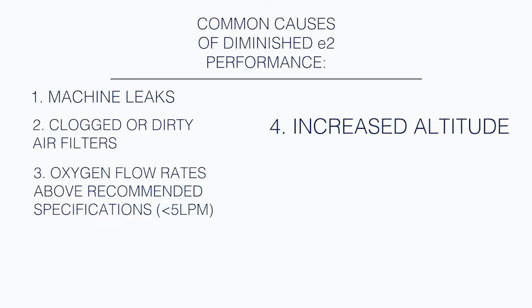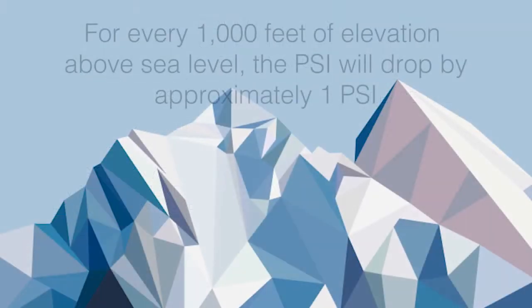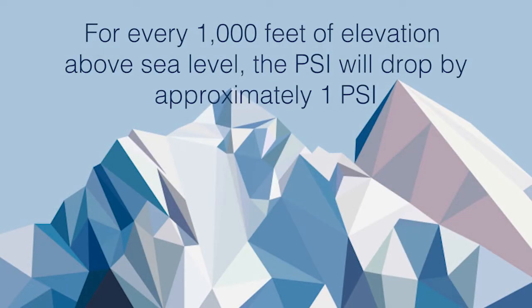Increased altitude. For every 1,000 feet of elevation above sea level, the PSI on your unit will drop by approximately 1.